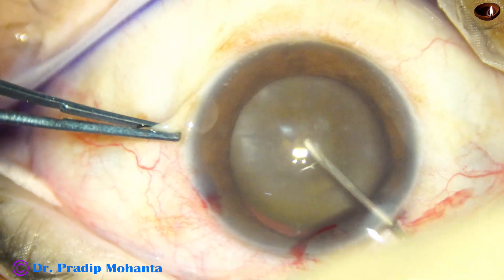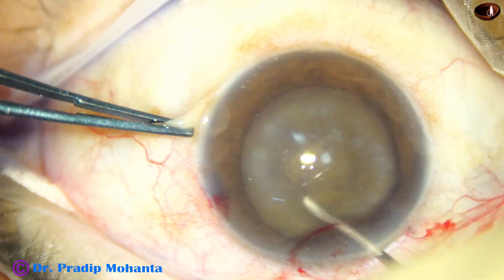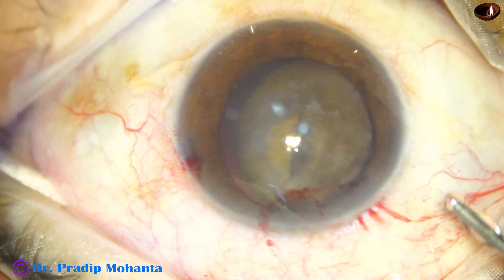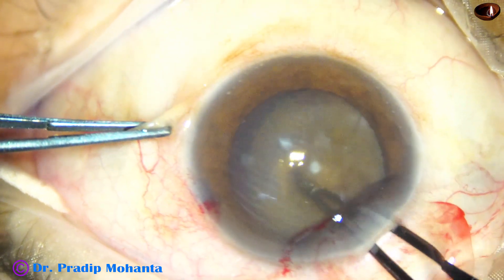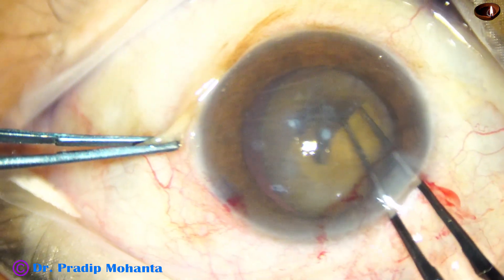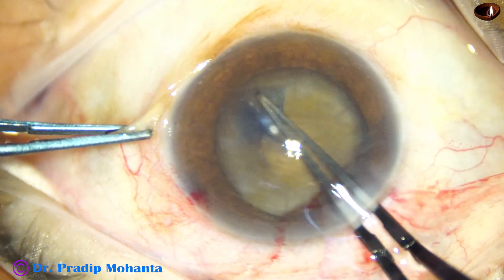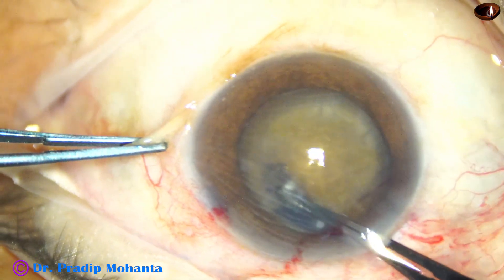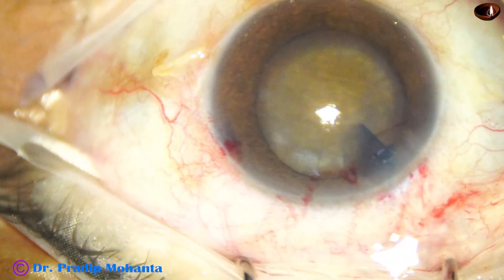Let us see how the rhexis goes. Yes, the zonule is weak, but I have been able to cut the anterior capsule with a sharp 26-gauge bent needle. I take the capsulorhexis forceps and gently try to do a medium-sized rhexis — medium-sized because if I plan a large rhexis and the capsular tag goes into the zonule, it becomes very tough as the zonule is already weak. The rhexis is done very gently and slowly, achieving about 5.5 millimeters.